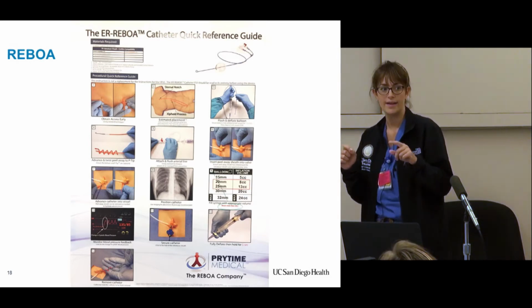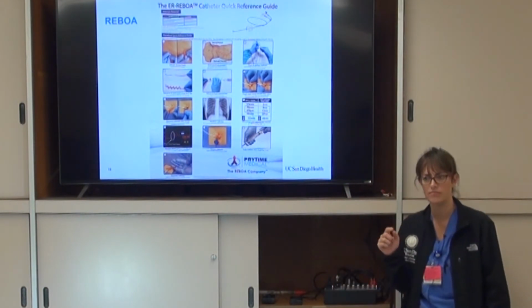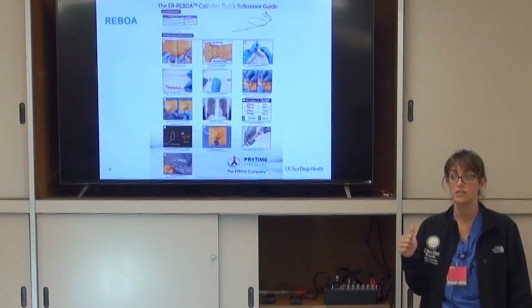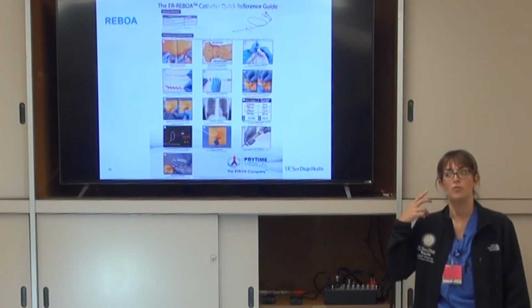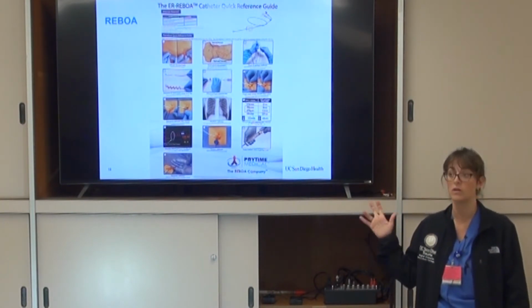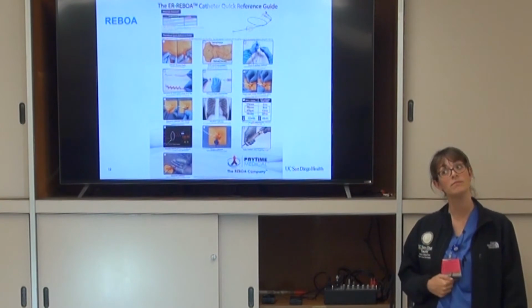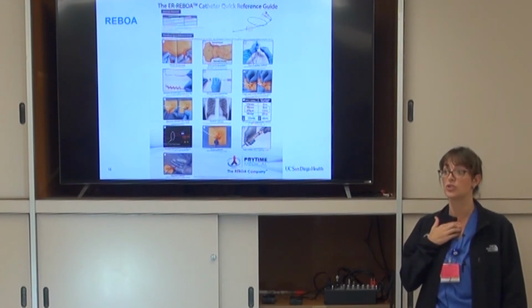Because you're going to be standing watching somebody do this, it's super important to help remind them, because we place these how often? How many times have you seen these placed? Right, okay. As you might imagine, with the lack of frequency that we place them currently, and they're relatively new, people will maybe not be as adept at doing this, and may be second guessing themselves. So having some basic knowledge about how they work is really helpful, because you can help remind them, oh, I thought maybe you meant to measure to the sternum, not to the umbilicus. Or maybe you meant to measure to the xiphoid or to the sternum, right?